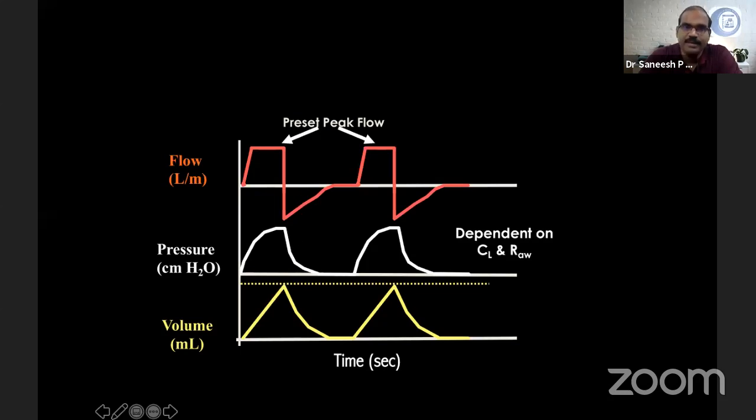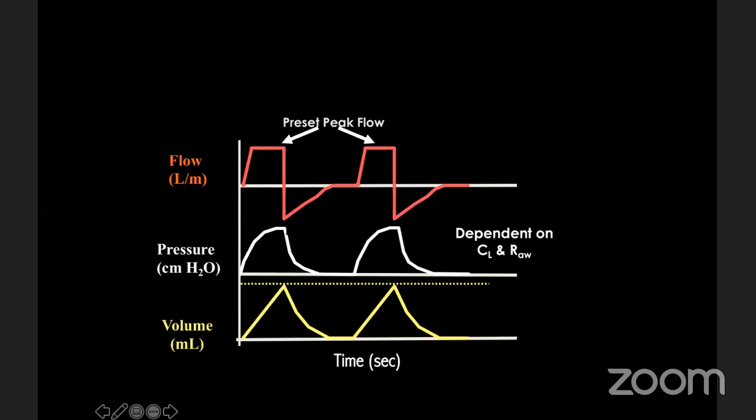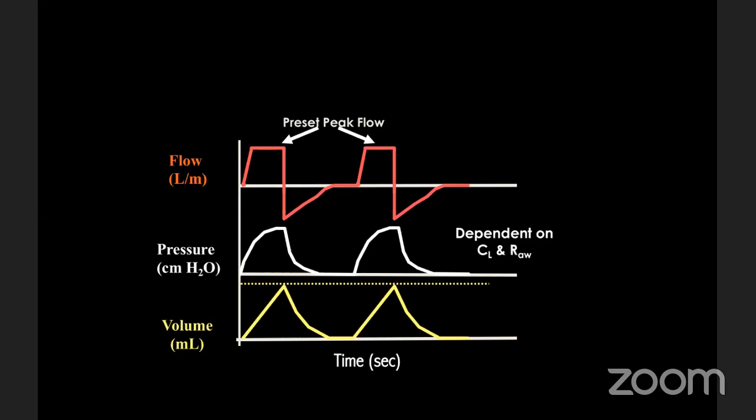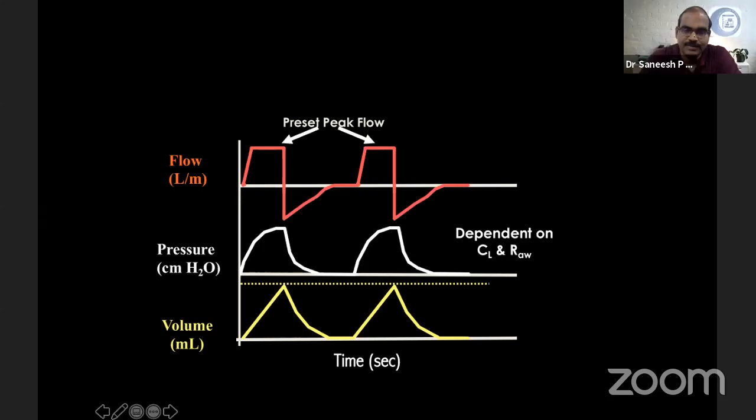Fine. So what is this pressure called? That is the peak inspiratory pressure. Peak inspiratory pressure. Suppose it is 40 and you are interested to know the plateau pressure. How will you do that? Then we have to press the inspiratory hold button and then check. Okay, inspiratory hold button for 1 to 2 seconds.